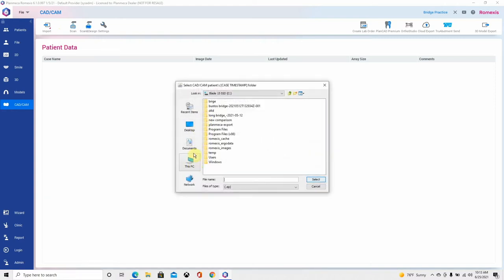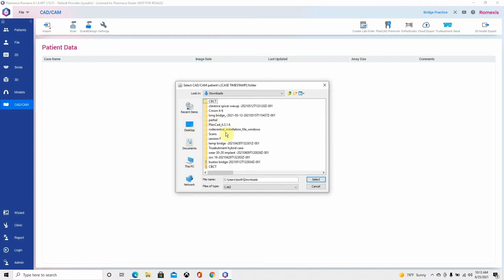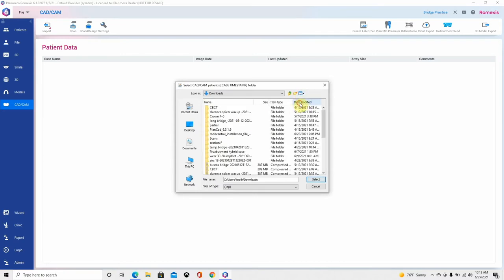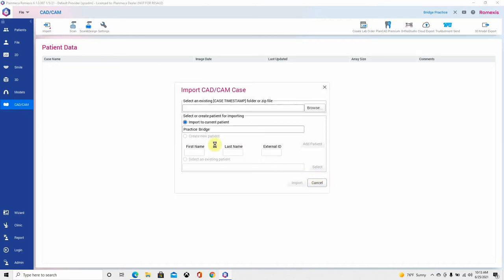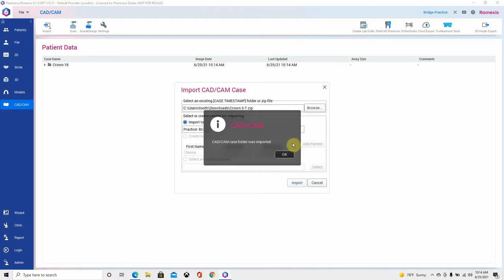We're going to find CAD CAM cases and import a single CAD CAM case. It's in my downloads — I don't know where it would be on your computer, depends on where you have that defaulted. I'm going to go to This PC, go to Downloads, sort by date modified. The folder is called crown3.7. I'll import that in — it does take just a bit of time. The zip folder contains everything: all my original scans. The CAD CAM case was successfully imported, so we'll hit OK.